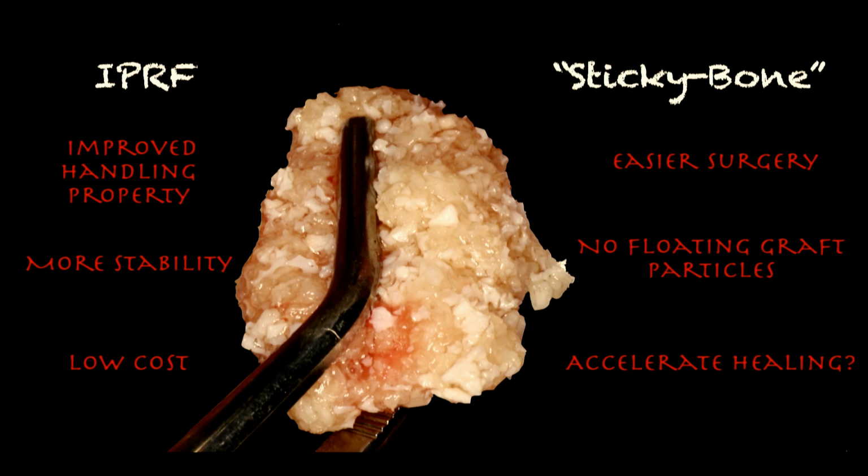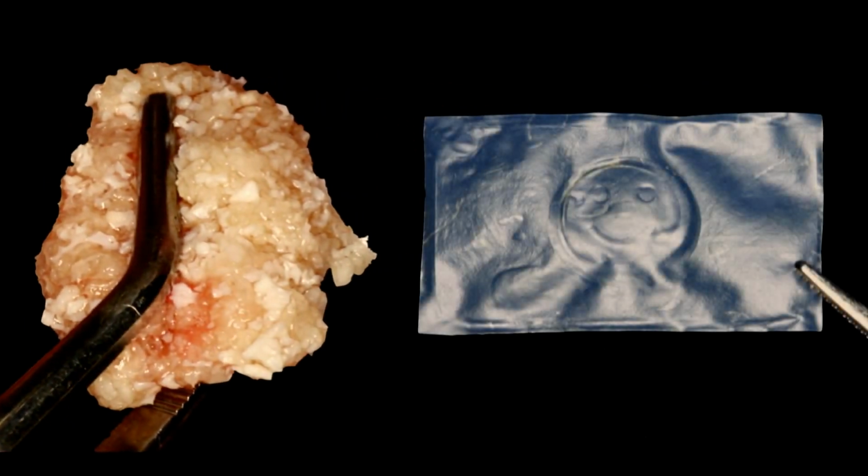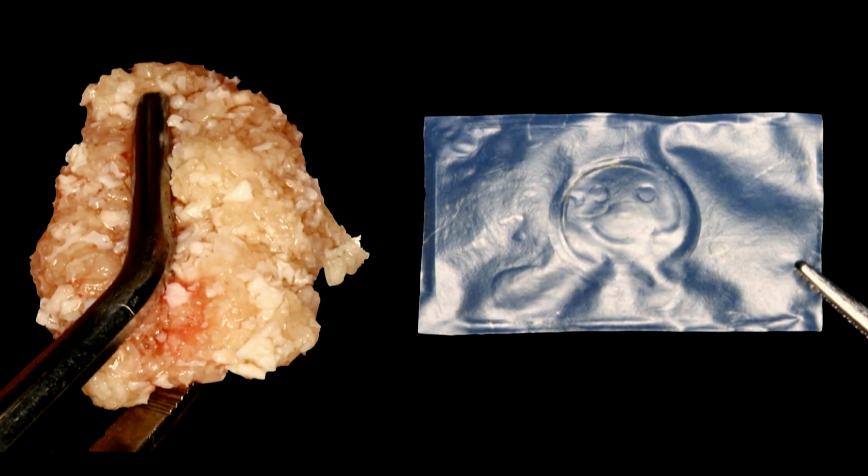Yeah, so PRF has become a big part of what I have incorporated in treating my patients. And I know the literature is divided on what benefits there are in terms of the gains you get with the bone, but undeniably the handling is much improved when you are using sticky bone. And we have to remember that this BioXclude is handled differently than the typical collagen membrane. And I'm going to show a case to show why I like to use sticky bone at all times when I am doing a ridge augmentation with BioXclude.